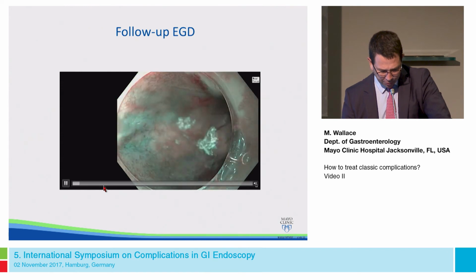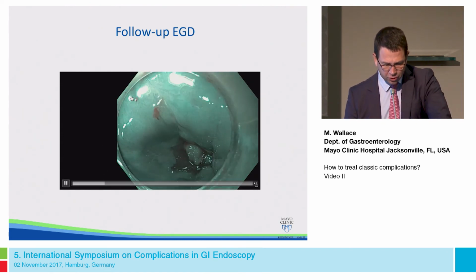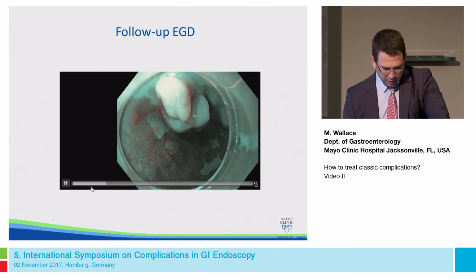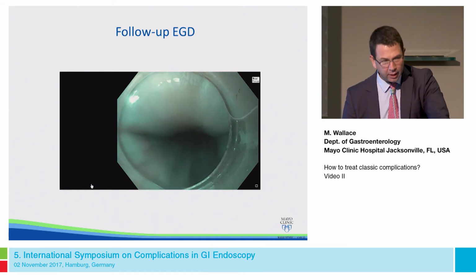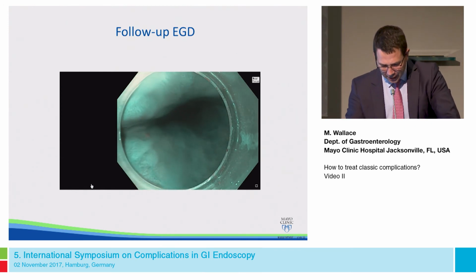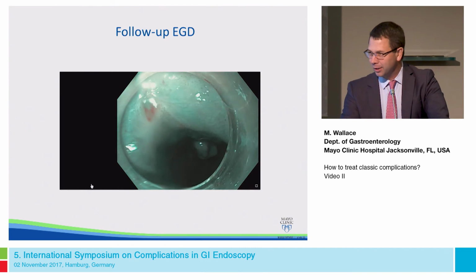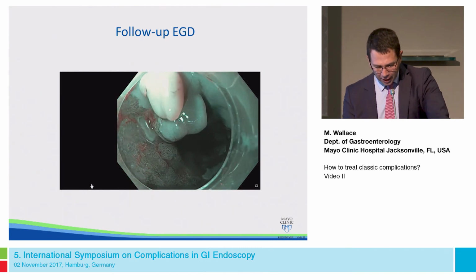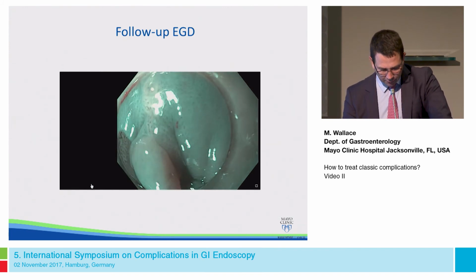And again, I'll just skip through some of this video here. What's quite impressive is how nice that surgical closure looks. There's some clip artifacts, but I think you can see this very, very clean closure line right there at 12 o'clock. Those clips produced almost, I don't claim to be a plastic surgeon, but if a plastic surgeon closed that esophagus, it might look a little bit like that, a very clean scar. On the other hand, we do have those large clip defects probably at the lower limit of the resection.